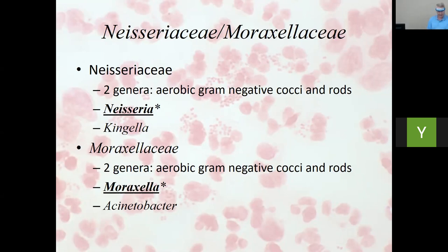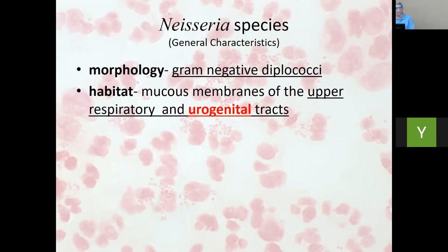If you were using your guide today, you would flip over to the gram-negative red side, the purple side. I didn't do it in color. Colors weren't that important for this. There are a few tests in here that you can see color with, but the detail of the names was the key thing. When you see gram-negative cocci, if you look way over to the right side, you will see Neisseria gonorrhoeae and Neisseria meningitidis. And if you go on down, you see your Moraxella catarrhalis at the bottom. Those are our three main ones we're looking at. You see the little test underneath each one, and that's what lecture is about today. So you basically have a little guide to look at.